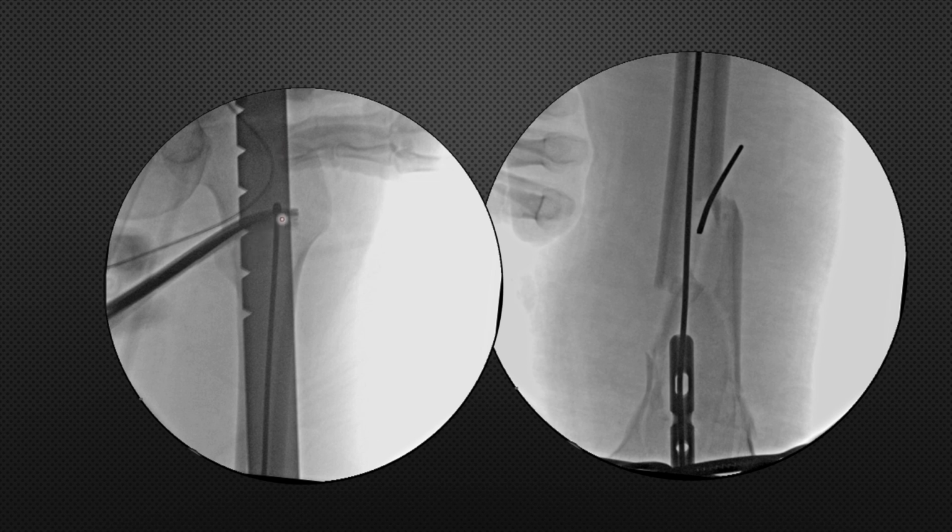The evidence suggests that the nail should never end in the diaphysis part, because if it is ending in the diaphysis part, it is going to create stress risers. So we have to be ahead of the LT, because at the level of LT, we have the diaphyseal-metaphyseal junction. Now you see we have placed a thick 2.5 mm K-wire in this part where we don't want the nail to go. And the nail will ultimately take the path here in this area, and the displacement of the fracture in valgus direction will be prevented.